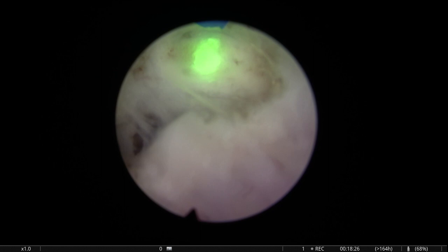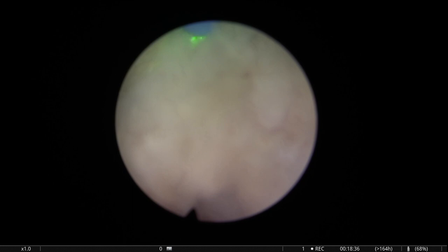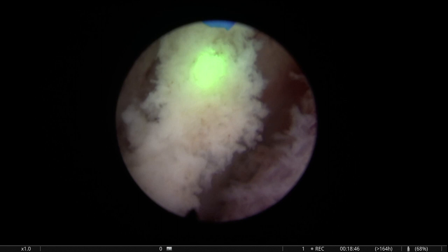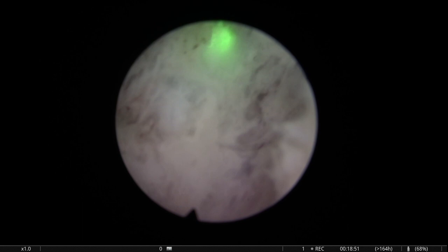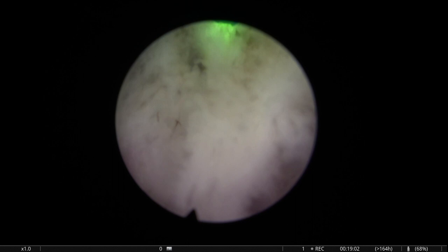So you see, as a HoLEP surgeon, you have to be a very delicate surgeon who can tailor your incision. And I think we will see also in the posterior aspect how that is true. You have to always have the feedback from what you're seeing, and adapt what you do to the situation. That was a deeper plane that I liked more, and I was trying to follow that plane.